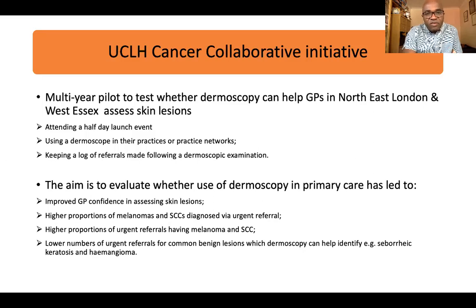And the aim of the collaborative initiative is for GPs to improve their confidence in assessing skin lesions, so that a higher proportion of melanomas and SCCs are diagnosed via urgent referrals. They also want to reduce the number of urgent referrals for common benign lesions, which dermoscopy can help identify, particularly seborrheic keratosis and hemangiomas.